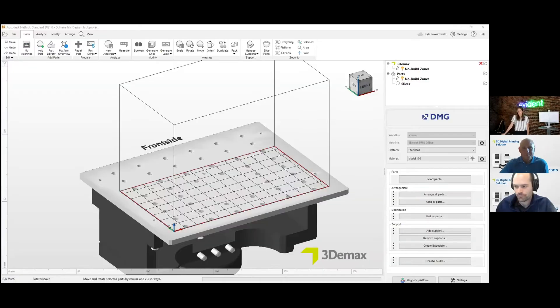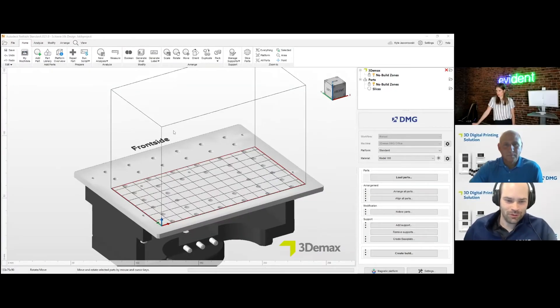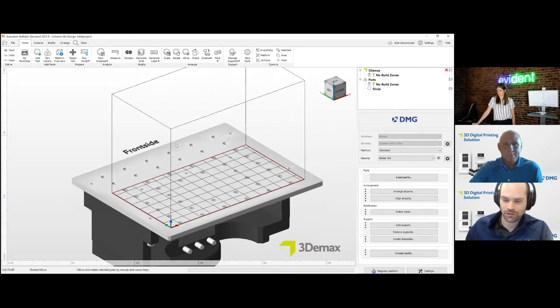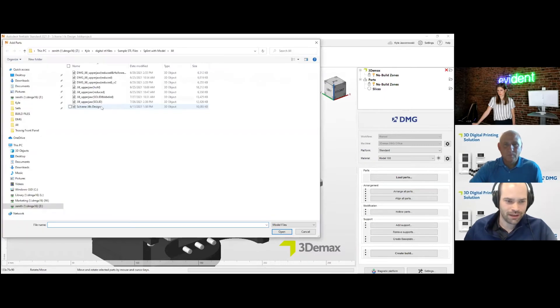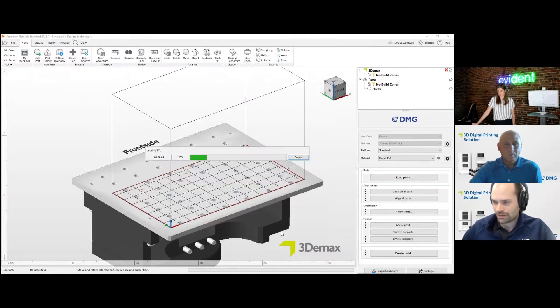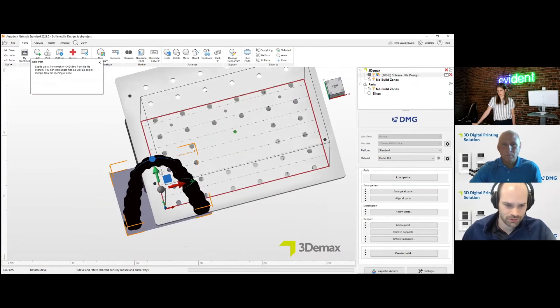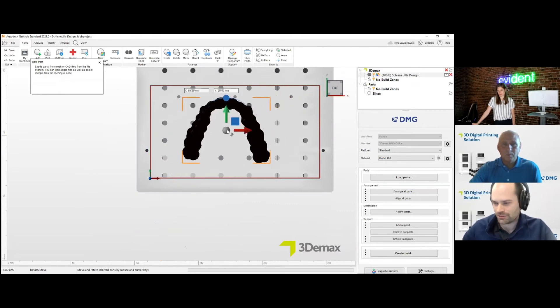I'm Kyle from DMG America, a digital specialist. I'm going to share my screen and show you NetFab, which is our nesting software. This is our virtual build plate — we bring our parts in here and turn them into something the printer can understand and print. The first step is to add your model downloaded from the Evident Design Center. Evident can also design and nest these themselves and send them to the printer if you don't want to do the nesting yourself.